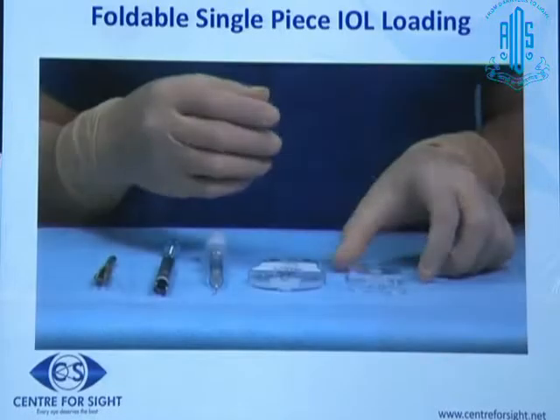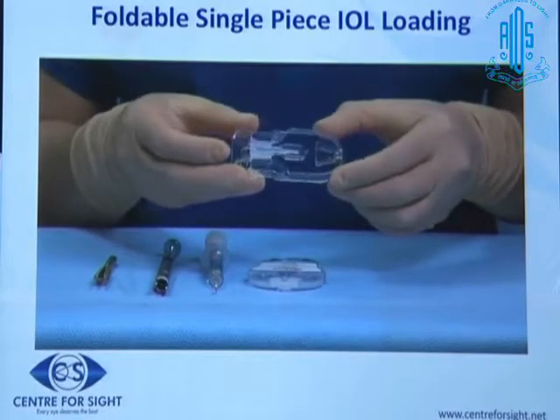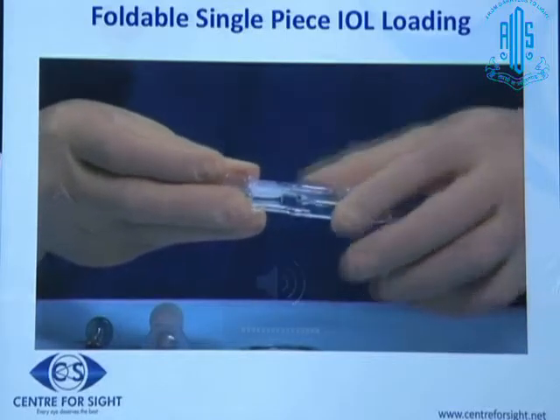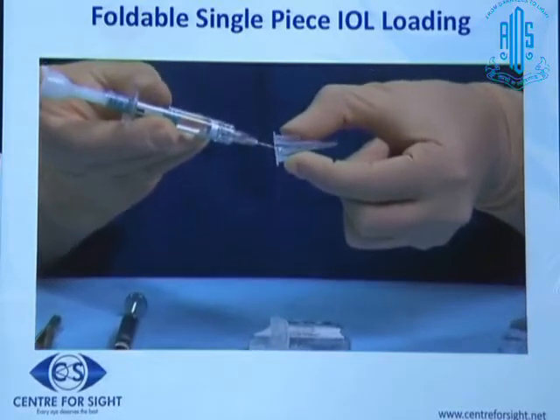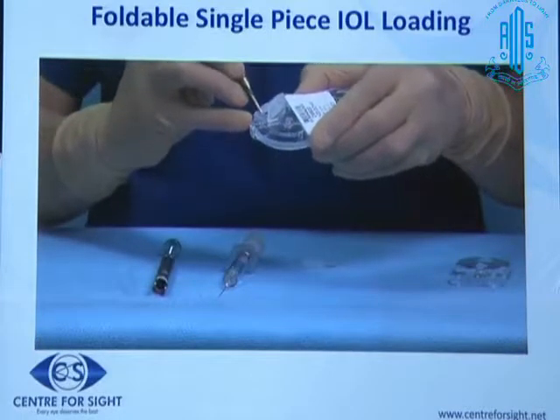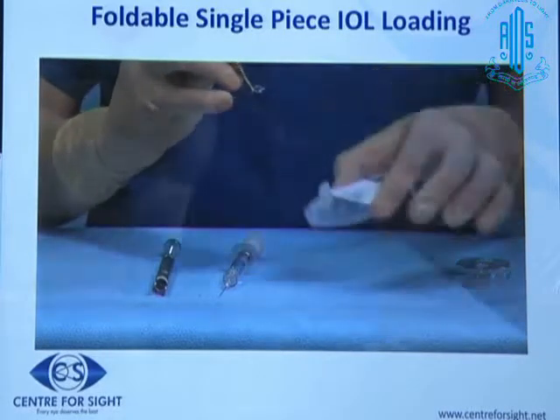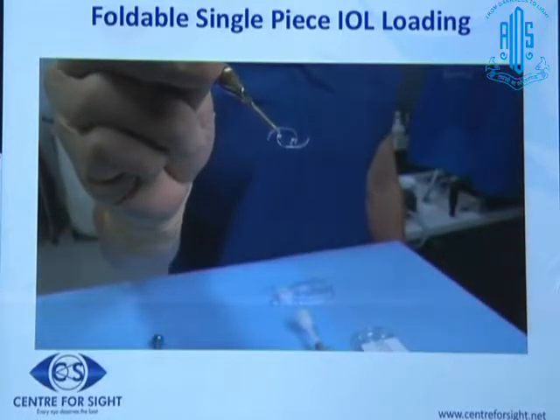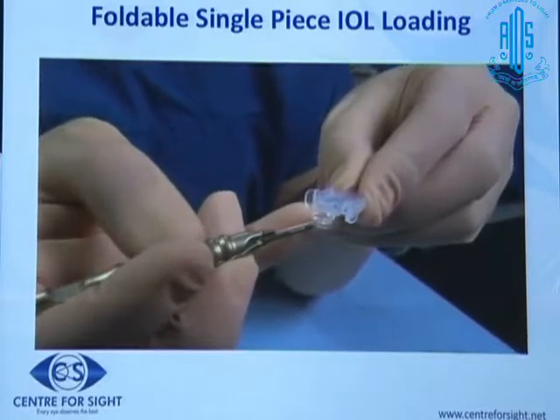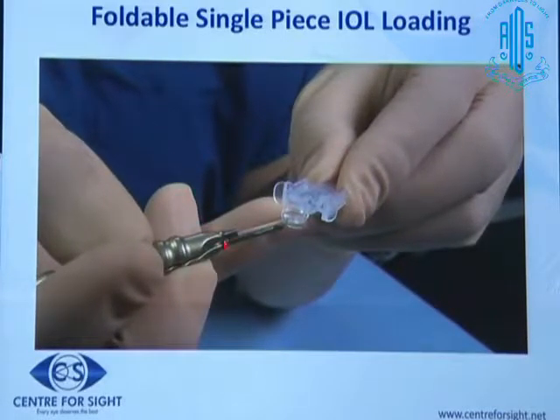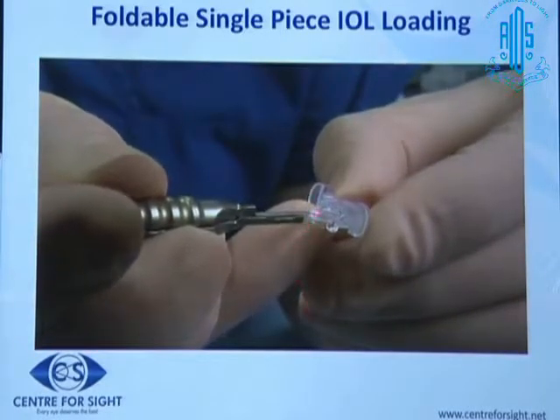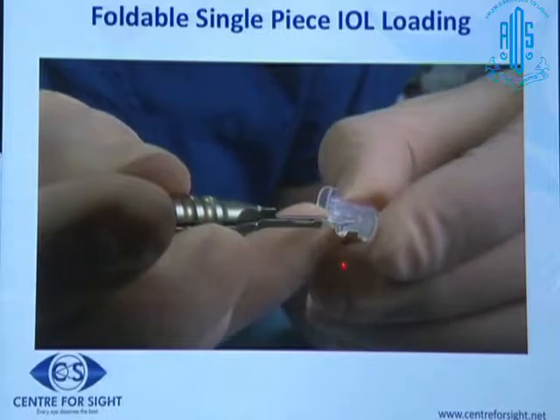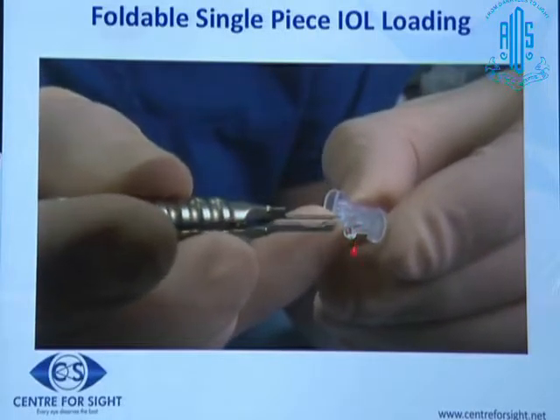For the Glopian Polar Platinum One Series cartridge: first remove the cartridge from the inner tray and fill with Healon viscoelastic. Next, grasp the lens with your forceps by the optic edge only and hold the cartridge with the IOL diagram facing up. Engage the lead haptic with the canopy and sweep the lead haptic over the optic body in one motion, leaving half the optic inside the cartridge.